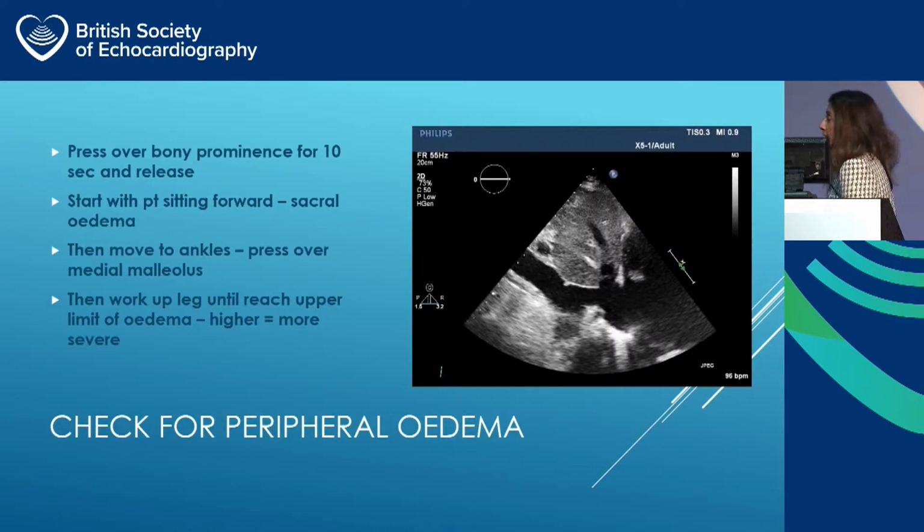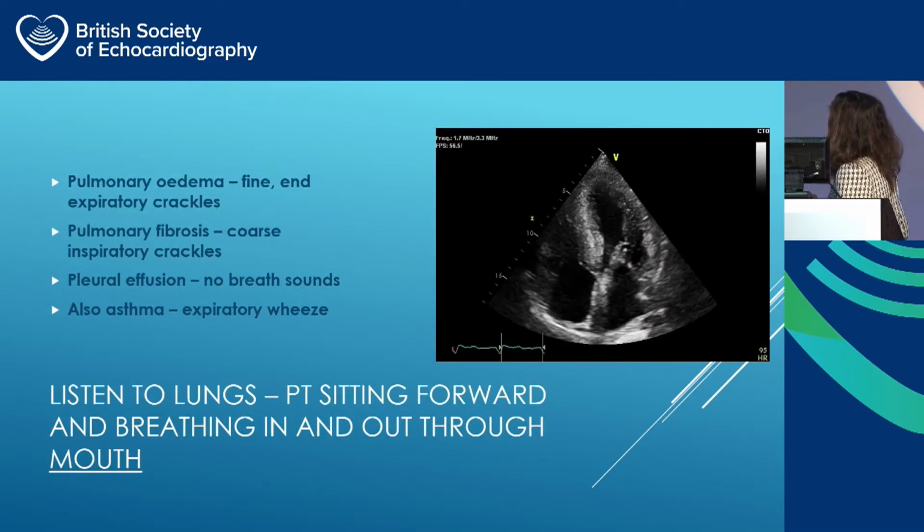Not a hope of that working either. That was an impaired LV with the speckling due to amyloid.